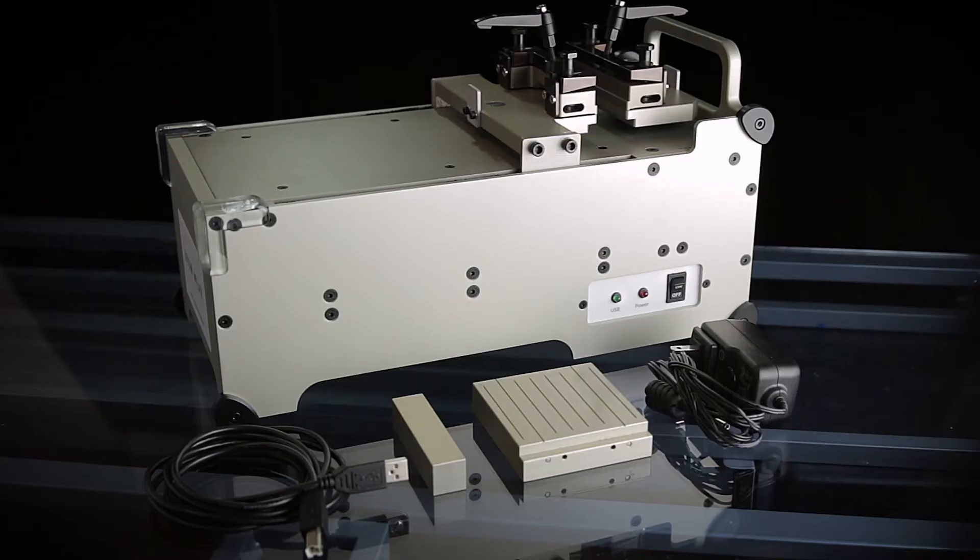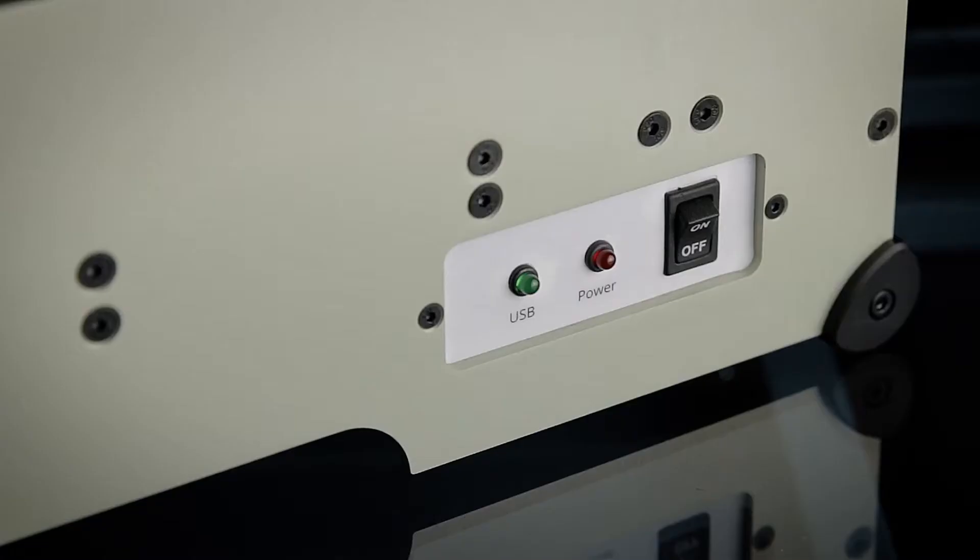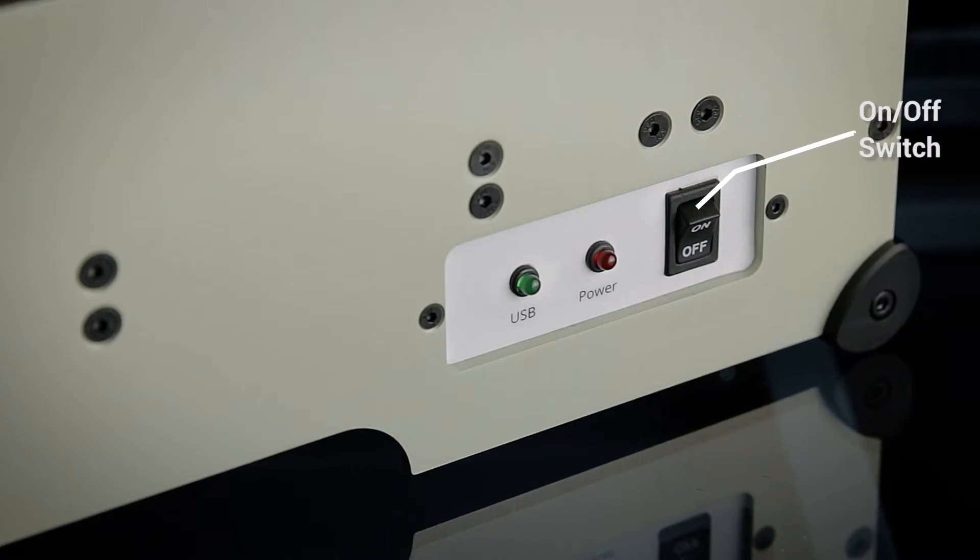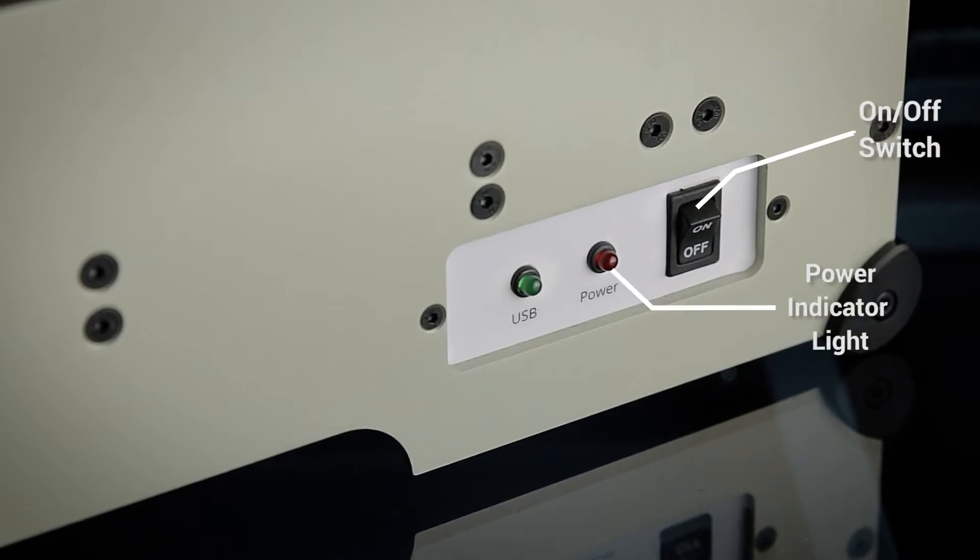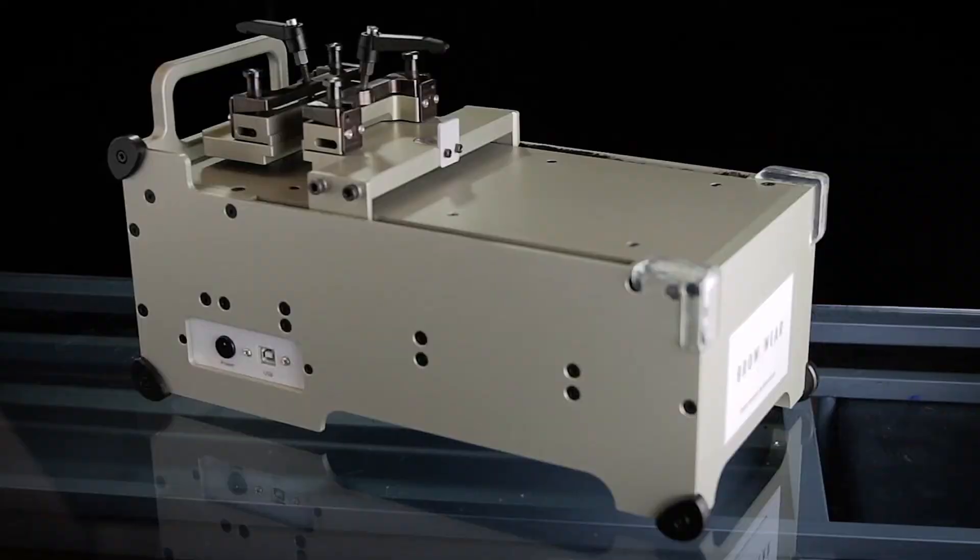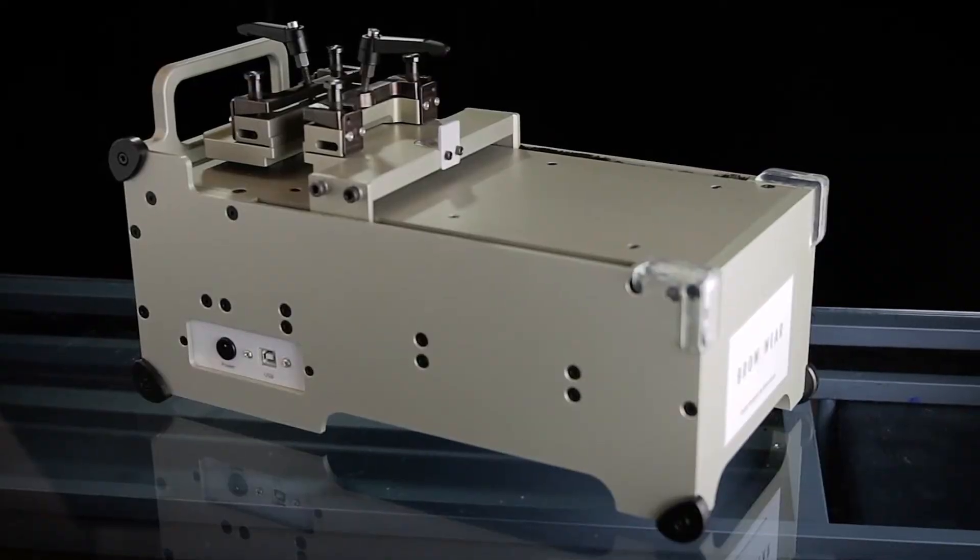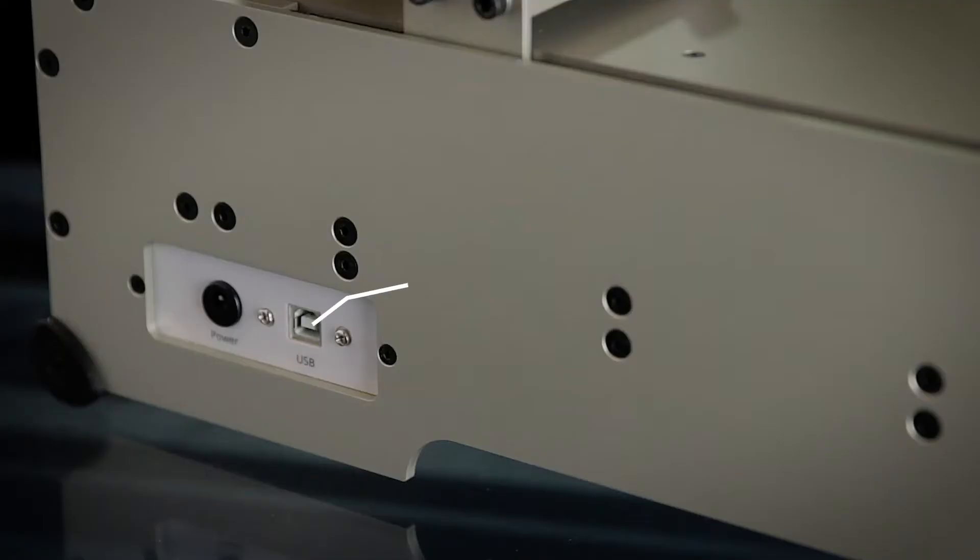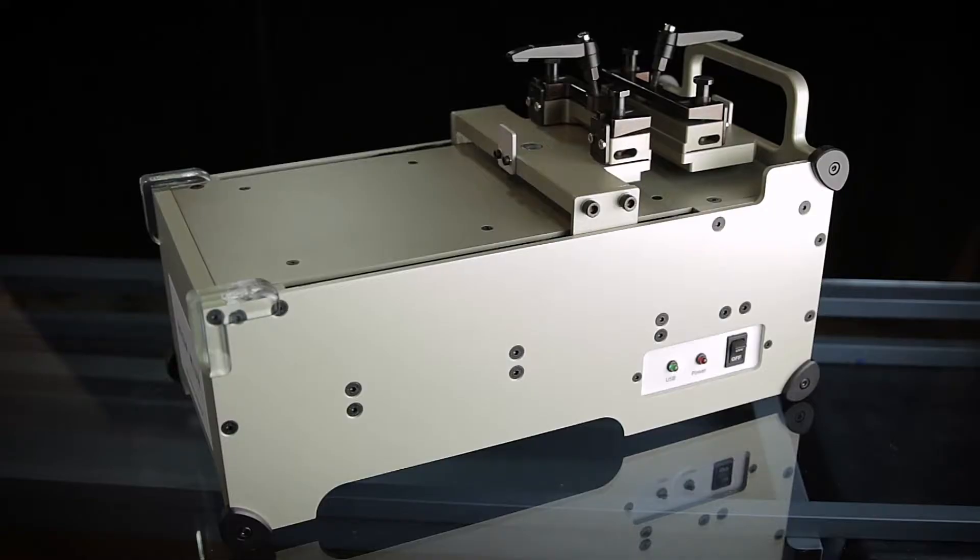On the right side panel, you'll see the on-off switch, the power indicator light, and the device connected indicator light. Located on the opposite side, you'll find the USB port and power outlet.